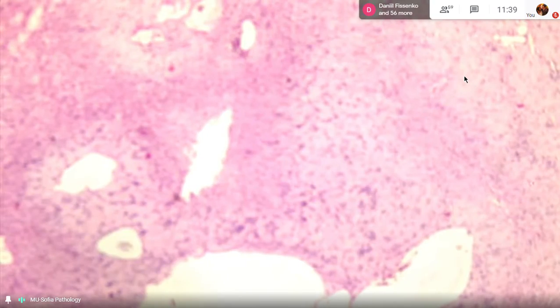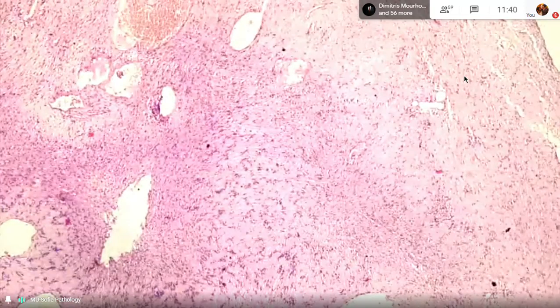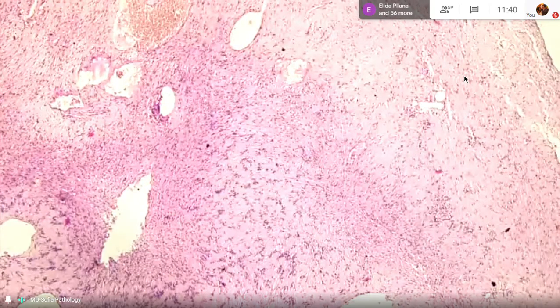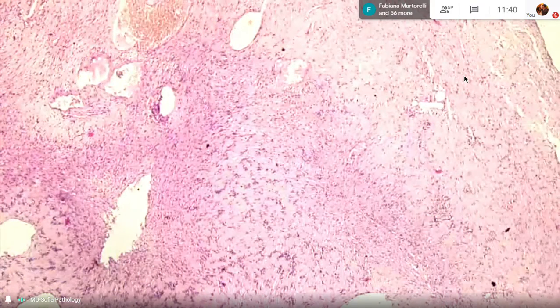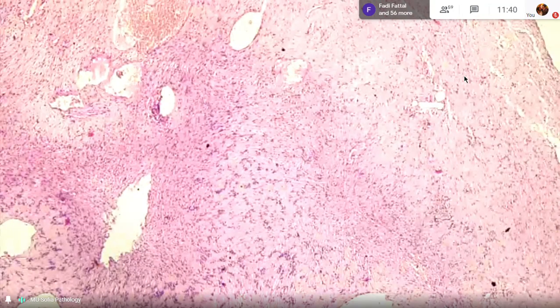Nevrinoma is a good example of a tumor of origin from the Schwann cells. These are the peripheral nerve cells. It can occur in the soft tissues. We usually call this schwannoma. If you remember, I said that this will be left for the tumor nervous system origin when we discuss soft tissue and mesenchymal tumors. What is interesting, look at the center.